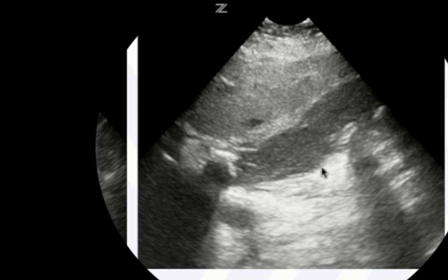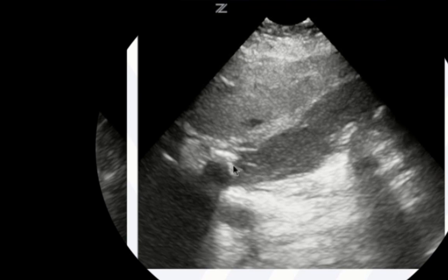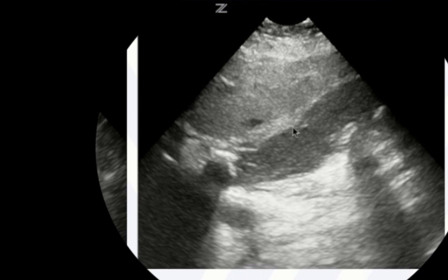In this long-axis view, a couple of findings: gray material that does not shadow — that's sludge — and also stones with shadows: a stone here with a shadow, another stone here, and down in the neck a good-sized stone with a big shadow. This is definitely cholelithiasis with sludge. Notice also the wall is no longer white, crisp, and well-defined — it's thickened. So this patient looks like they have cholecystitis. There may also be a little pericholecystic fluid, though we'd need to scan through in real time to confirm.